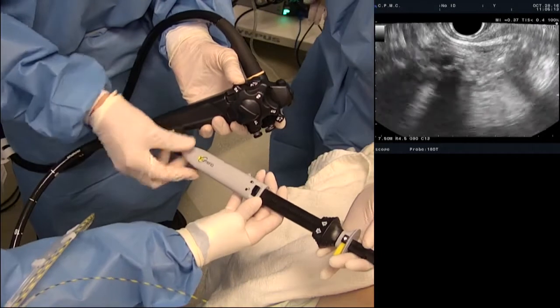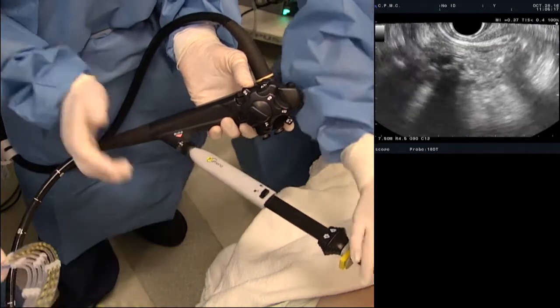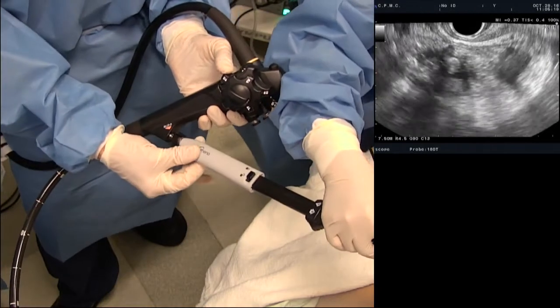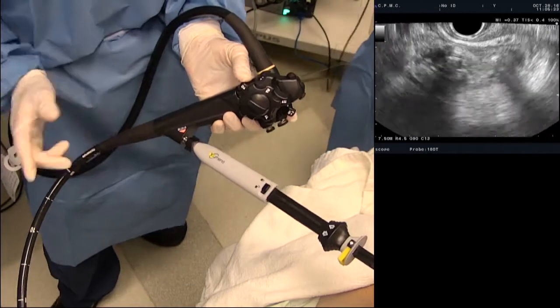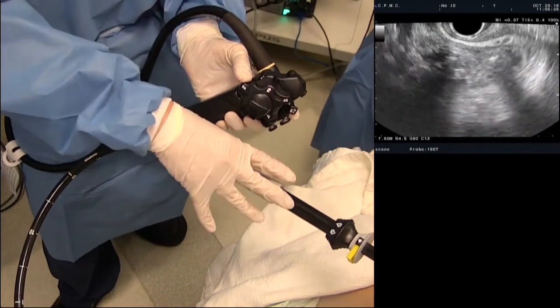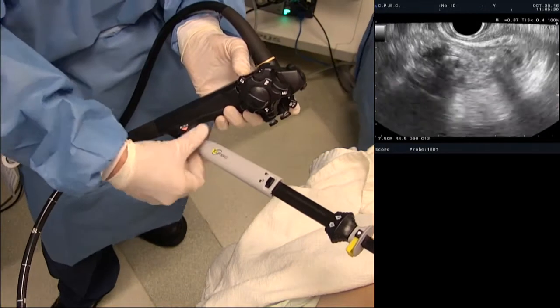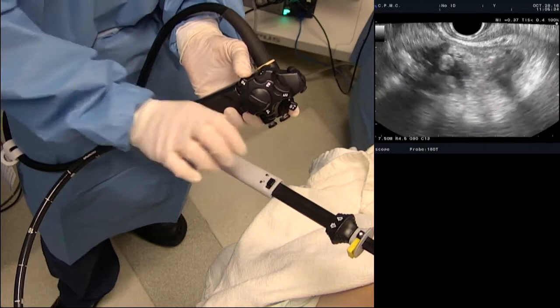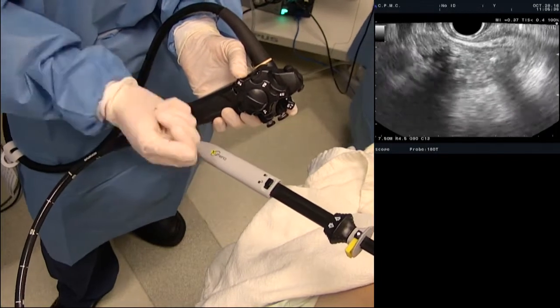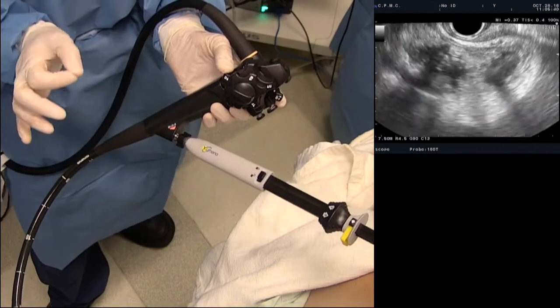So now I am luer locking this in. That's no different than an FNA needle. But we also have the advantage that this is a swivel luer lock so that we can actually change the rotation. Now, it so happens that we're looking right at the face where the markings are. But it could have been that when we tightened our luer lock, this could have been on the opposite side. And we would, of course, want to turn that towards the operator. That's what the swivel function is for.